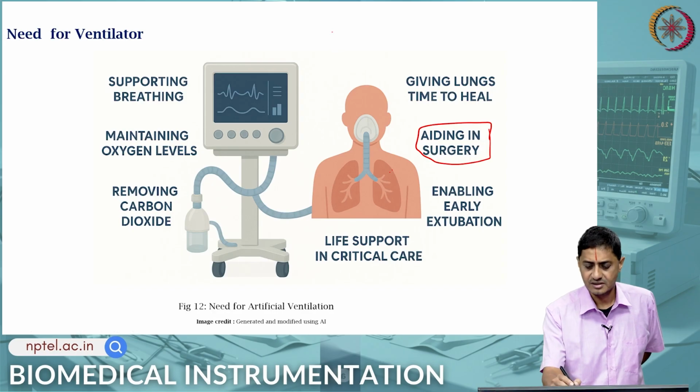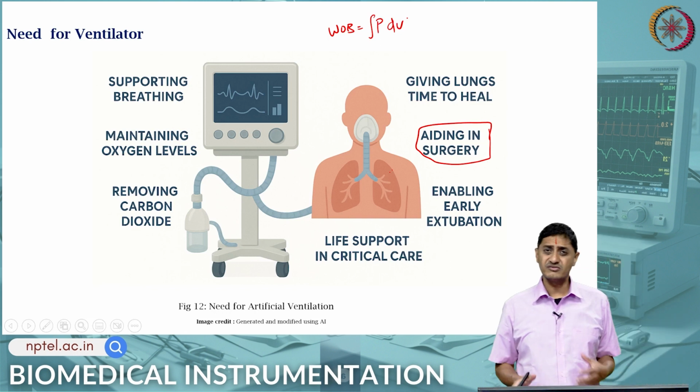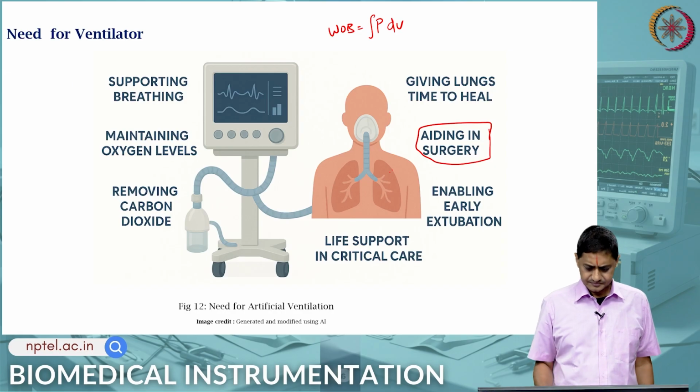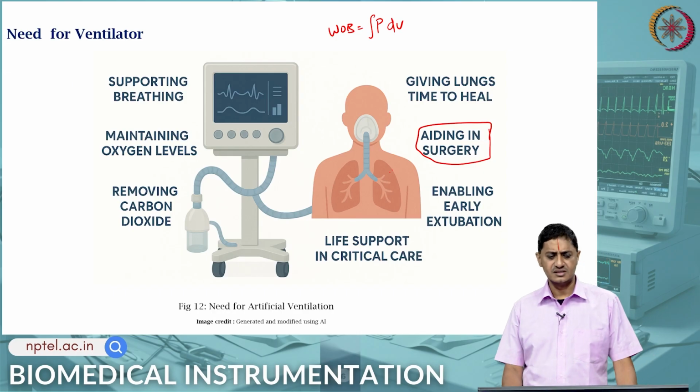Okay, from here there is such a thing called work of breathing. What is this work of breathing? This is essentially the integral of P times dV. It is a product of pressure times volume, measured in joules per liter, for example, of oxygen breathed in.